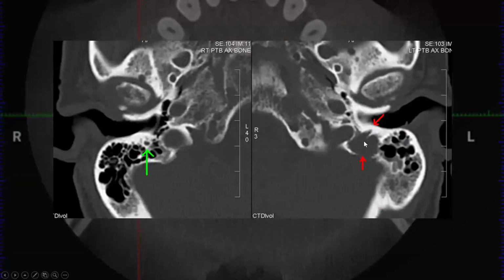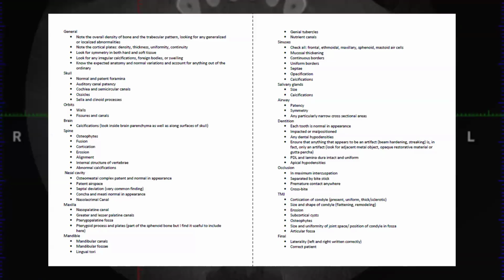I wanted to say it was a multiple myeloma, and that's what this turned out to be. It could be a number of things, right? But this was a skull-based tumor that, if you're not familiar with the anatomy, would really blend in with everything else around it. You might look at this and say it's somewhat detailed, but compared to the anatomy that I could start listing if I looked through a medical CT book, this is pretty narrowed down.